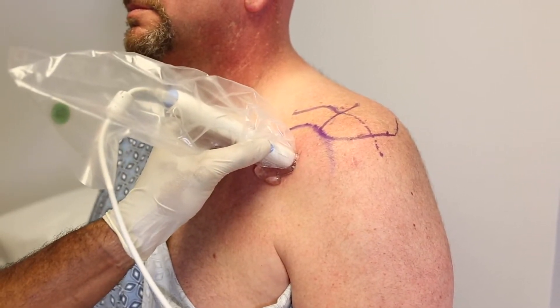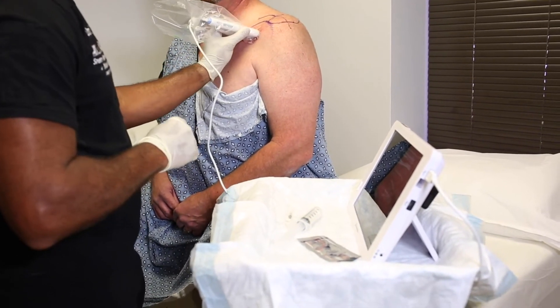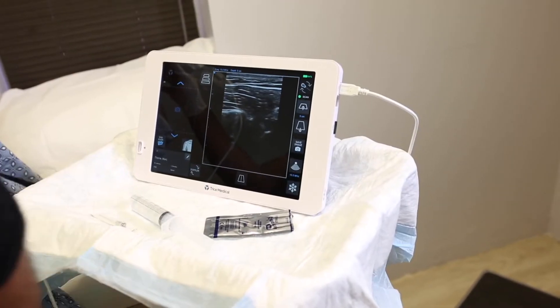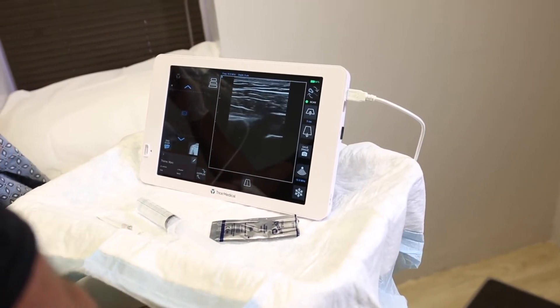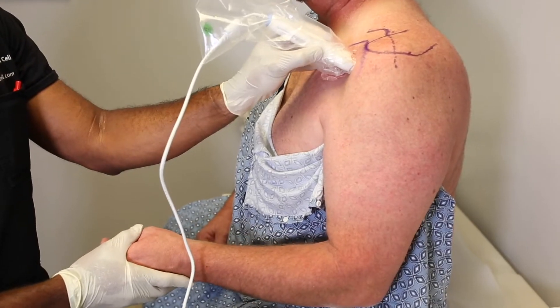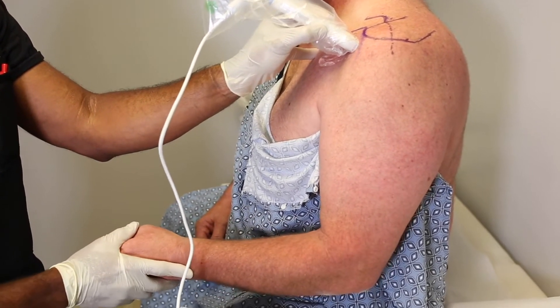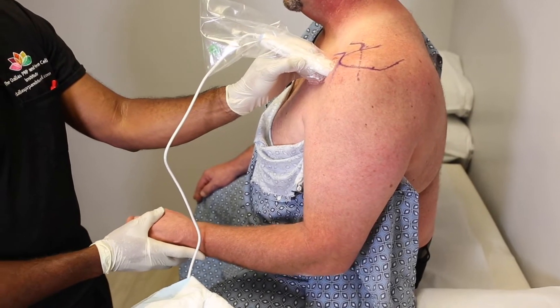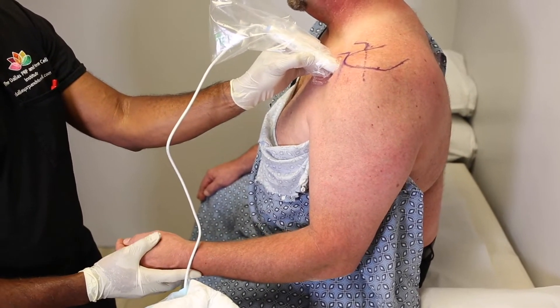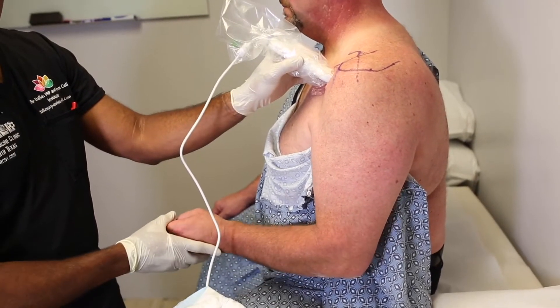Our goal here is to identify the medial aspect of the coracoid because that's where the suprascapular nerve is. We have the transducer provisionally aligned and can easily identify the coracoid on the ultrasound display. Using dynamic motion of the arm in internal and external rotation, we can see the excursion of the subscapularis tendon deep to the coracoid. The coracoid presents as a hyperechoic or bright white line that does not move with arm rotation, making its identification easy.